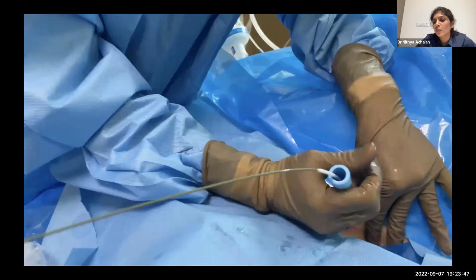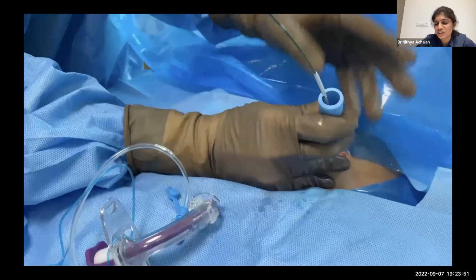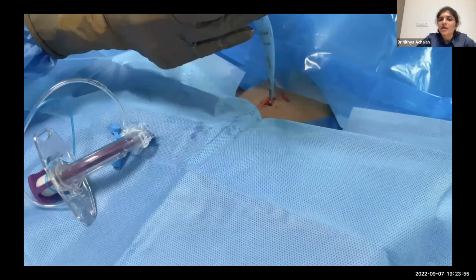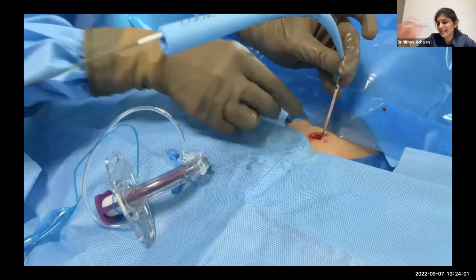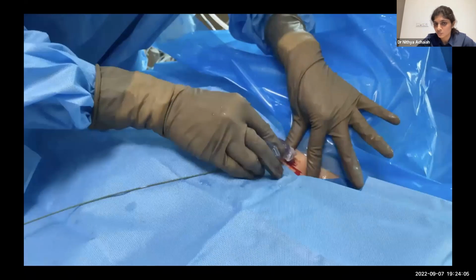Once that is done, we connect the ETCO2 and confirm the position of the tracheal tube. If you're using a bronchoscopy guided technique, then the bronchoscope itself can be introduced, and under vision it can be confirmed directly. So here we do it with the ETCO2.